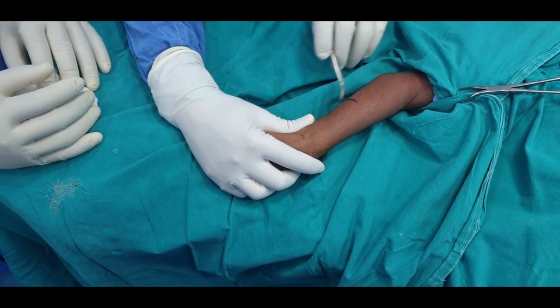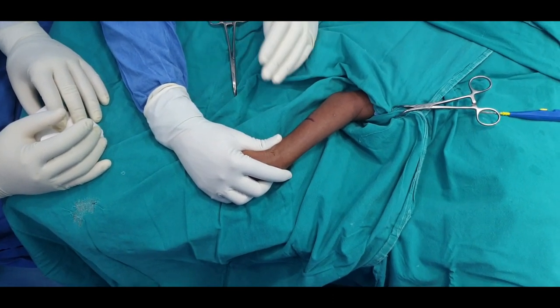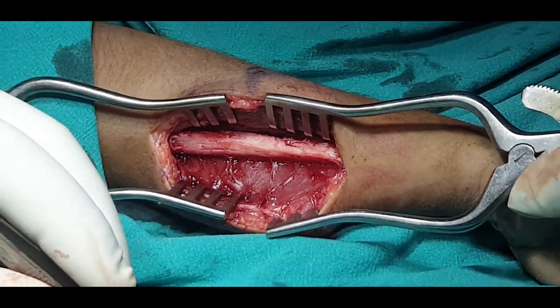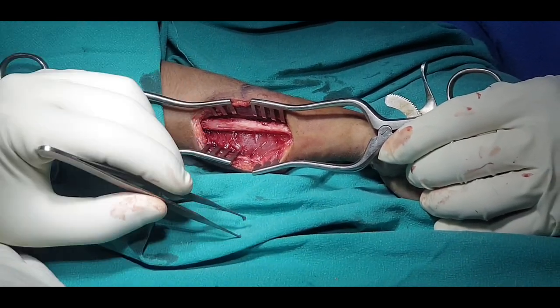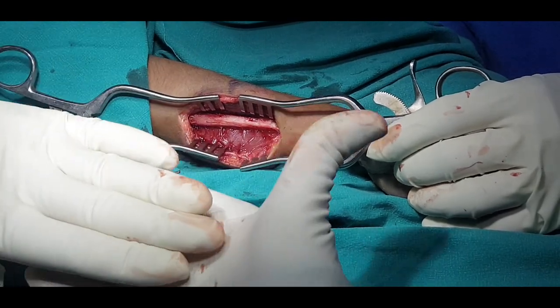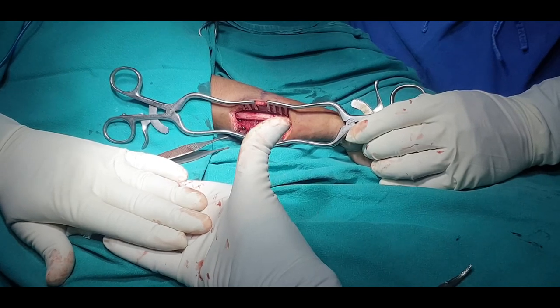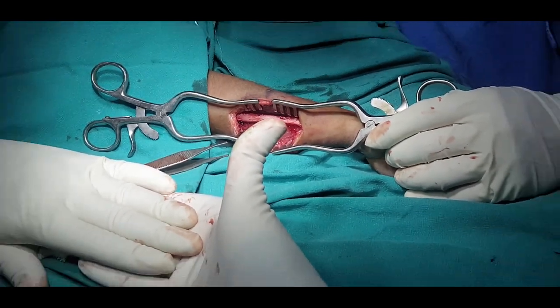Next step will be to open the ulna and do an osteotomy. I will skip to the osteotomy stage. I have made my incision directly over the ulna, as you would do for any ulna shaft fracture. This is extensor carpi ulnaris and this is flexor carpi ulnaris — I have gently reflected it off. I am going to make an oblique osteotomy so that even when I lengthen it, there is bony apposition and the bone will subsequently heal. I am less optimistic on this case because it is three weeks down the line and there is a good chance we may have to open the joint.